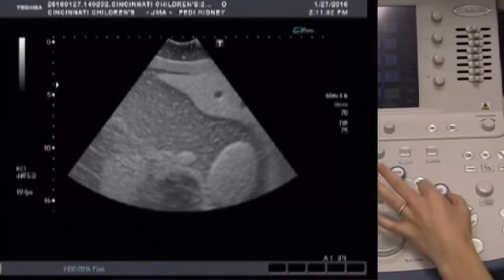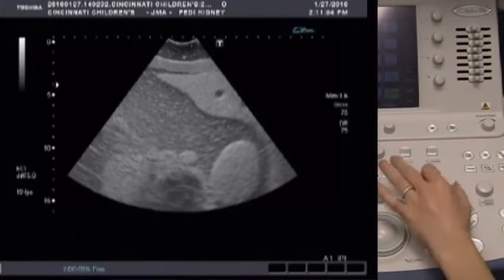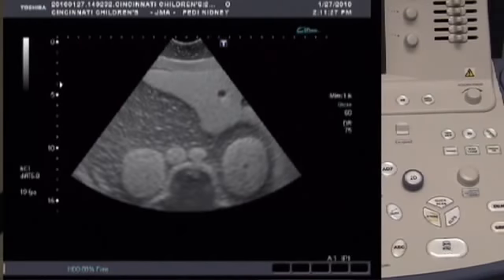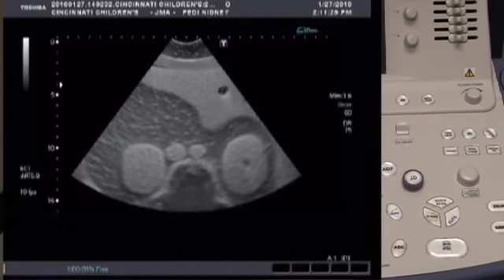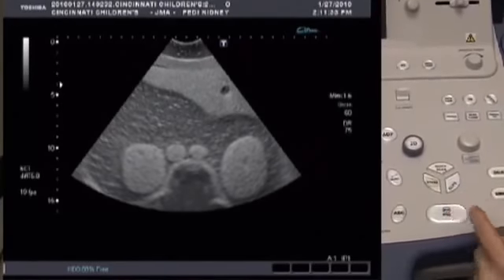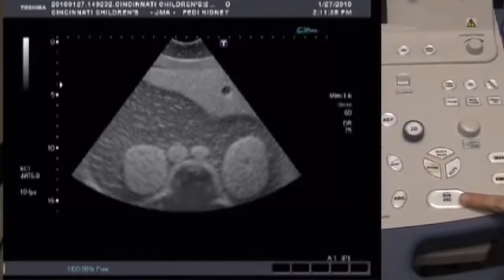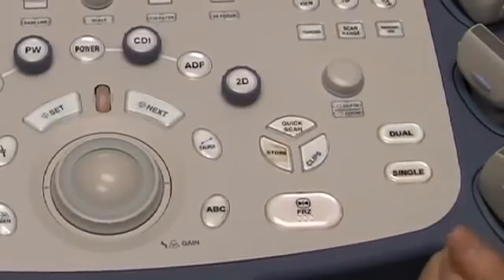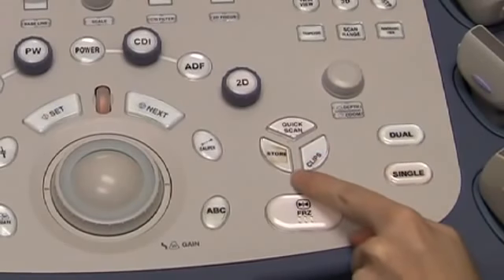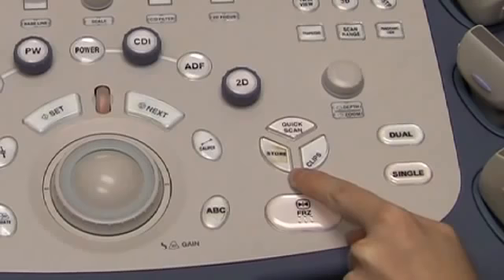Push down and then turn the 2D knob to lighten or darken your image. To freeze your image once you have the image you want, press the freeze button. Once you have an image you like and want to upload to PACS, press the store button — it automatically uploads the image to PACS.